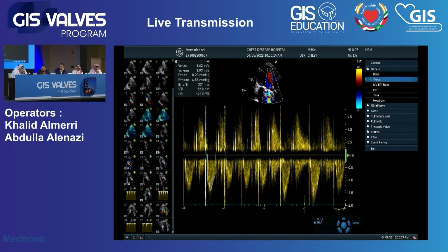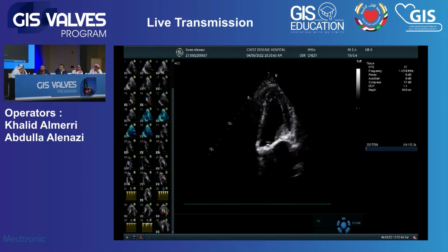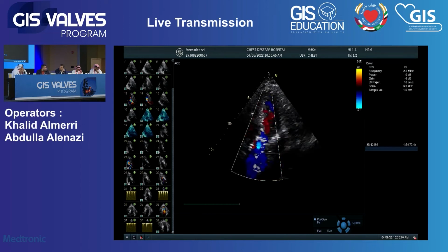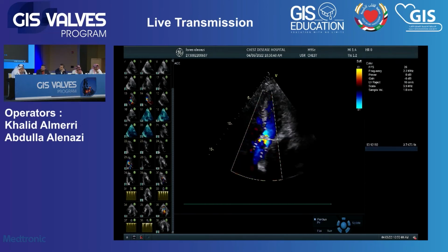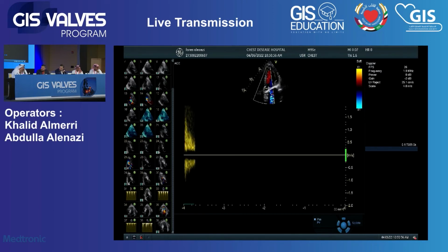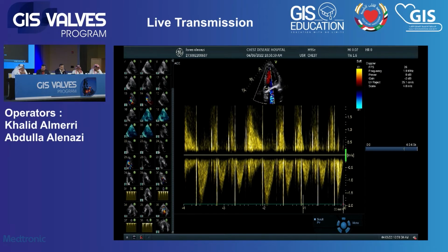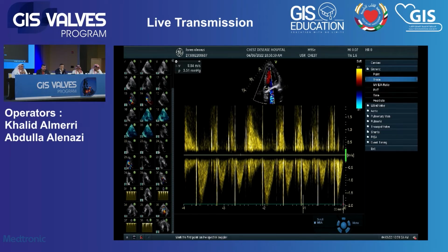In our center, for instance, we are doing it in almost 90% of cases now, and we always find debris. But what I want to say is we are still far from showing a long-term clinical outcome benefit from this device. But we think there is certainly some rationale behind it and some evidence already available. And Dr. Lafont, do you want to comment on this Sentinel device in this situation and where we are so far, and how is your practice in your center?